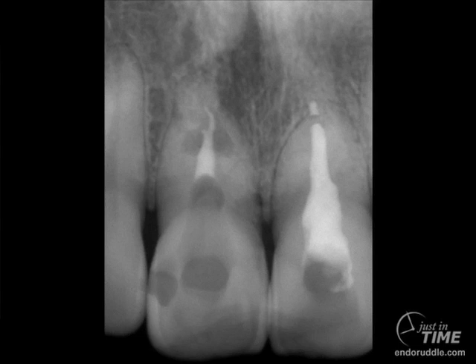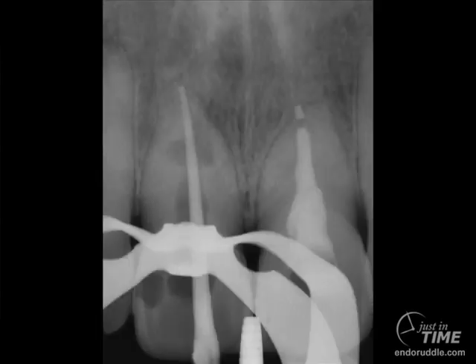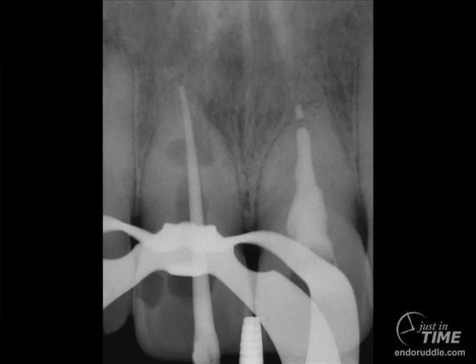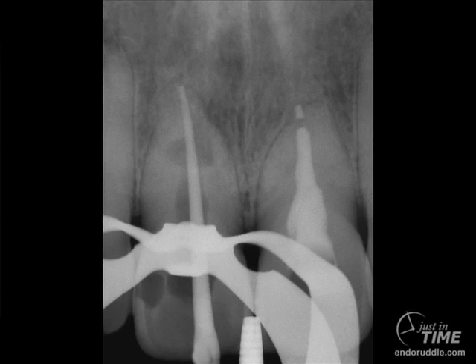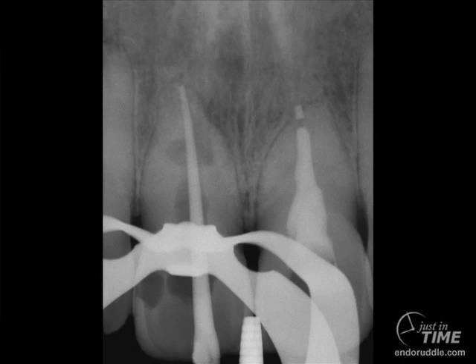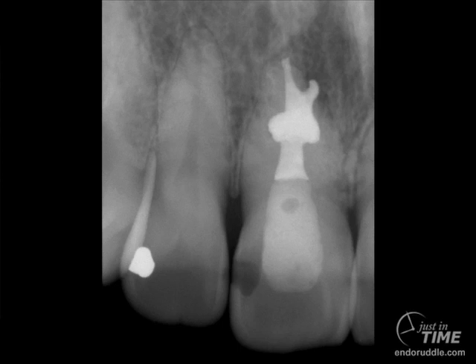Retreatment we'll talk about at another time. But when you see teeth like this, there is a rationale — there are objectives for filling root canal systems. With a little bit of disassembly, we've regained access, shaped the canal, and fit a cone. We can syringe in some injectable thermosoftened gutta percha lateral to the master cone, which encourages better hydraulics when we commence the down-pack phase of warm vertical condensation. Through a series of heatings and condensations, we soften the cone and mold it precisely into the shape of the root. The postoperative image is fairly exciting — complete endodontics has been accomplished, and I'm happy to report my friend still has this tooth 20 years later.